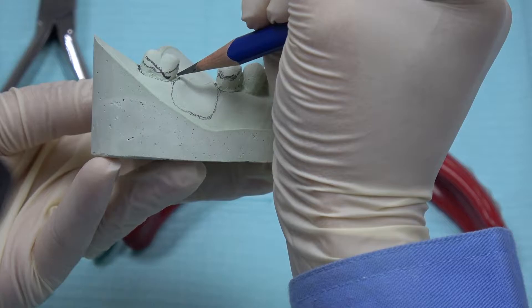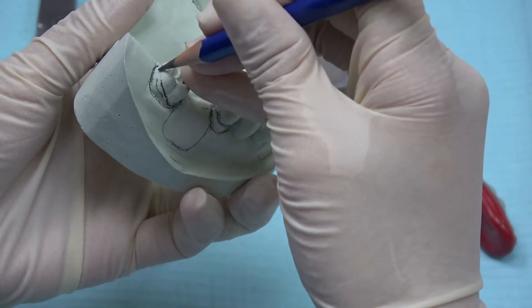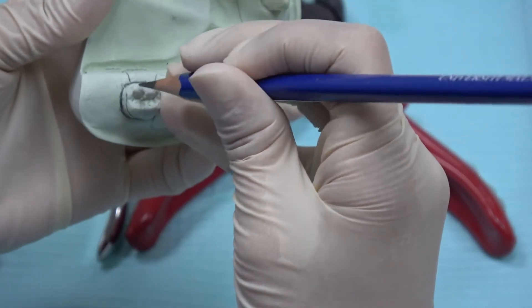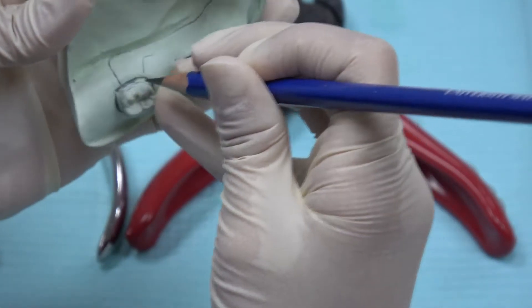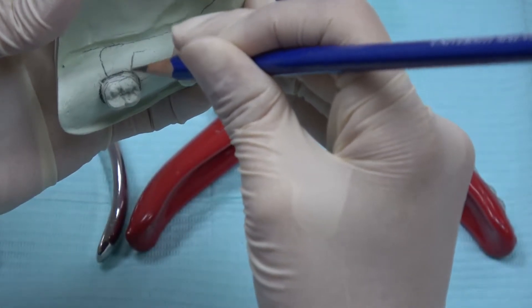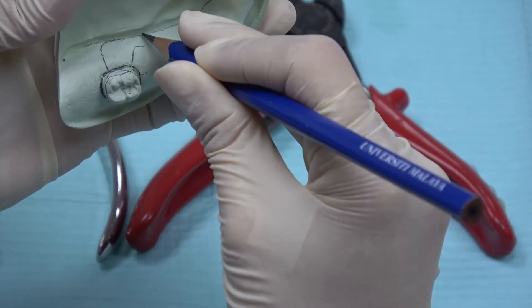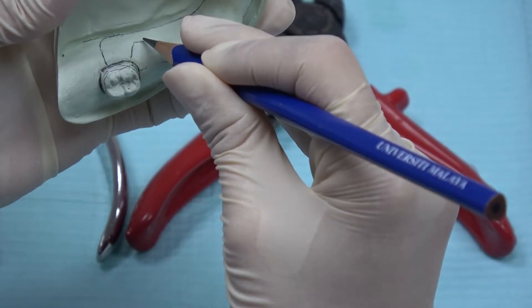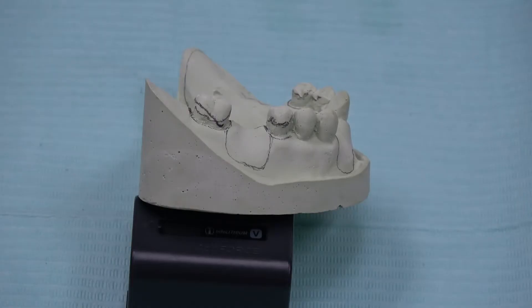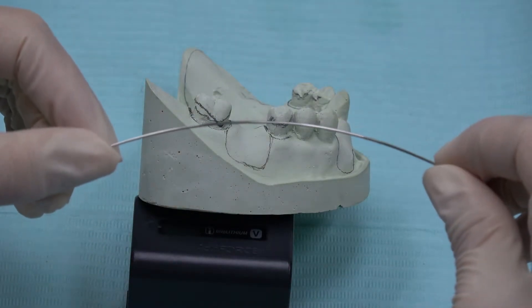It should not be very close to the gingival margin and it shouldn't exit to the interproximal area. Draw the design of the ring clamps and draw the design of the tag too. Please make sure the tag of the components is not too long and it shouldn't go up to the surface area. I am going to show you how to bend ring clamps, and we are going to use stainless steel wire 0.7mm.